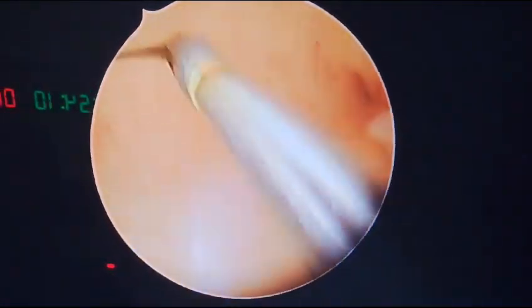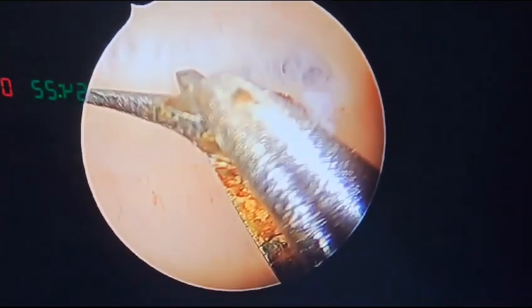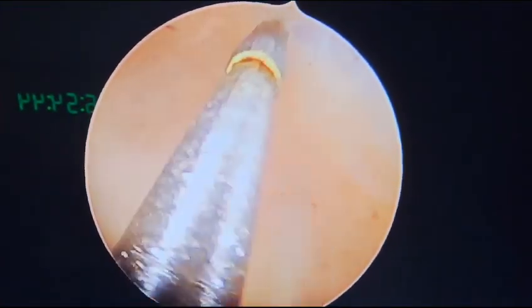At the fundus there is a slight arcuation, which we will release. The guide for releasing arcuation at the fundus should be the bilateral ostia, both in terms of depth as well as in terms of the site for release of fundal arcuation. So always undercut as compared to overcut. We can see the myometrium clearly now. Umair Saab will slightly zoom in so as to have better video. Yes. So this is the fundal arcuation we have released.